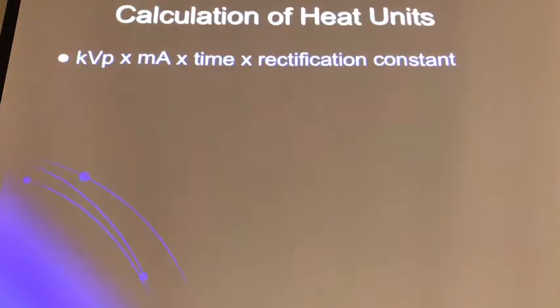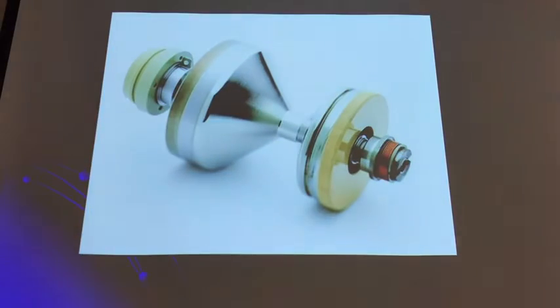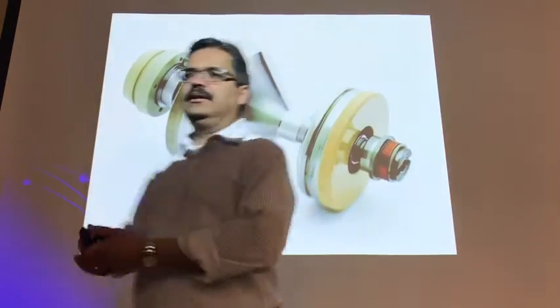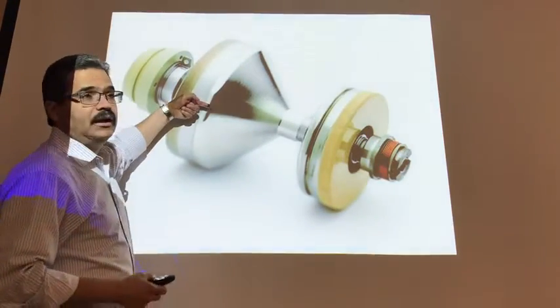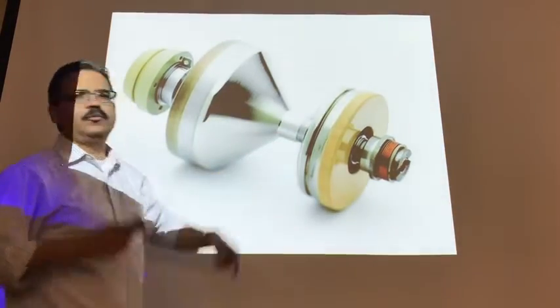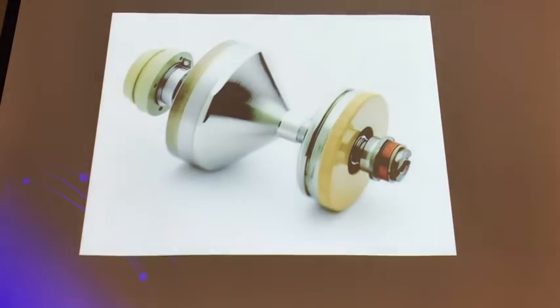All right, just to show you a few things, guys. This is a picture of what a metal tube looks like. This is a Siemens design, and this is what they use in CT. The cathode is on this side and the anode is on this side. They direct all the electrons. They have nowhere to go, so they bombard it here. So it works more like an electron gun.